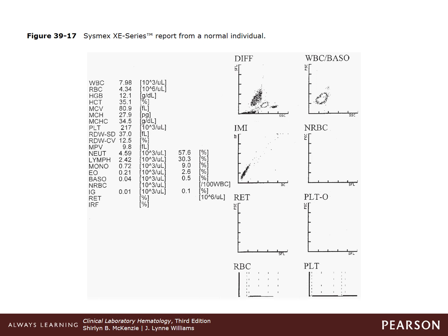Here the platelet count from the RET channel is designated as a platelet optical count, and is compared to the platelet count from the RBC platelet distribution. If the platelet count is extremely low, the count from the RET channel is reported because the result is more accurate.